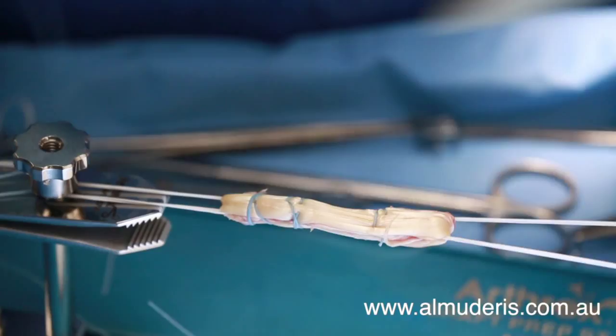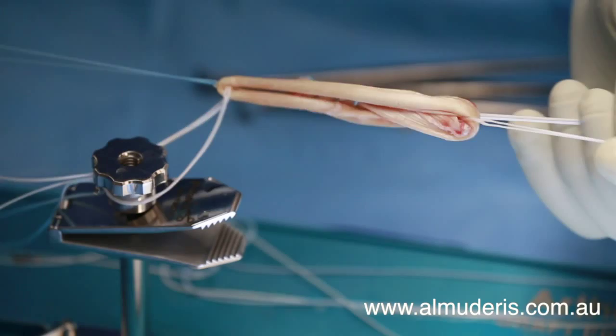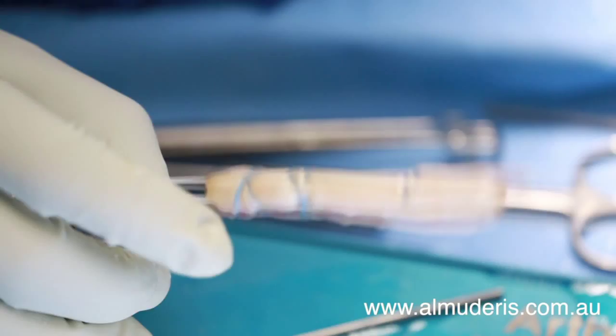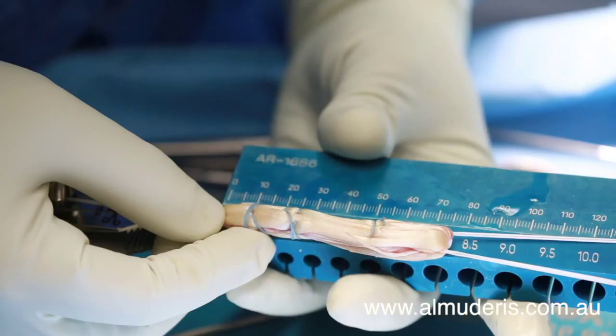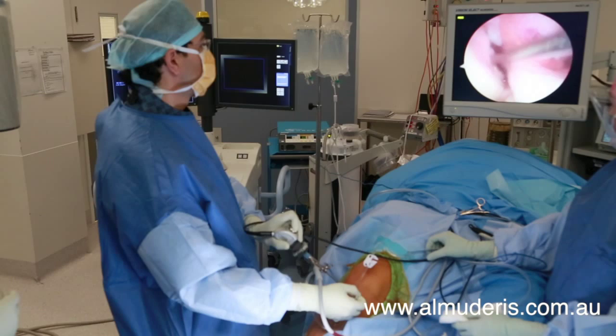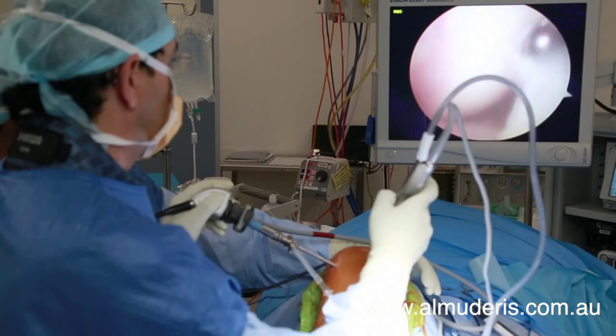Once prepared, the construct is measured for length and diameter and kept in a safe location while the rest of the operation proceeds. Under arthroscopy, the ACL can be identified as detached from its regular femoral insertion point.